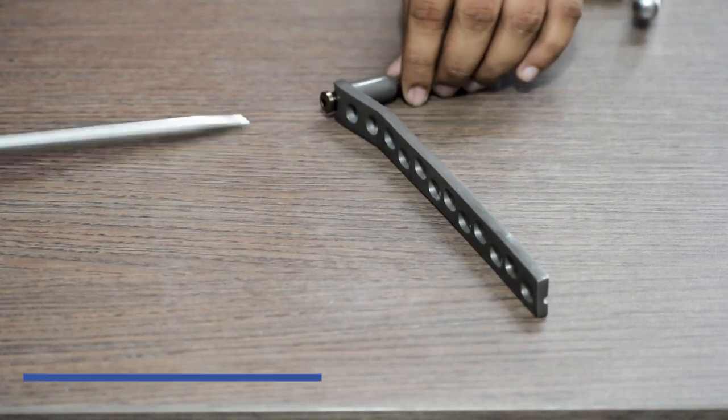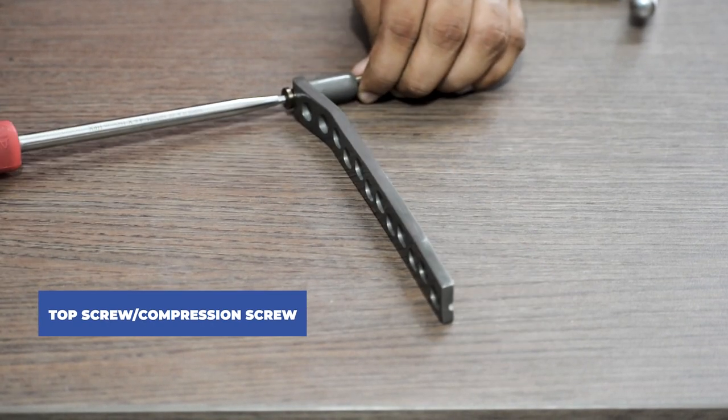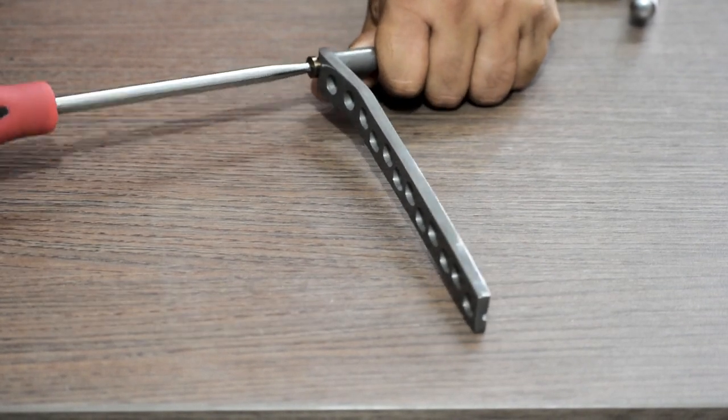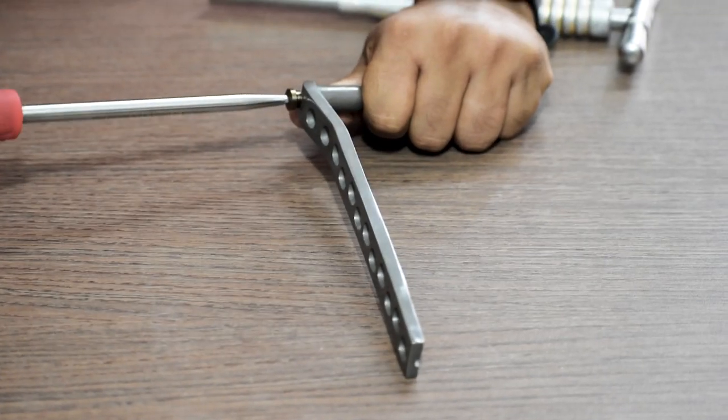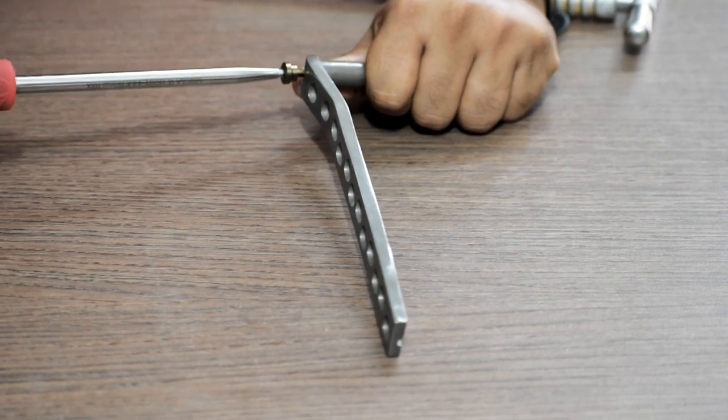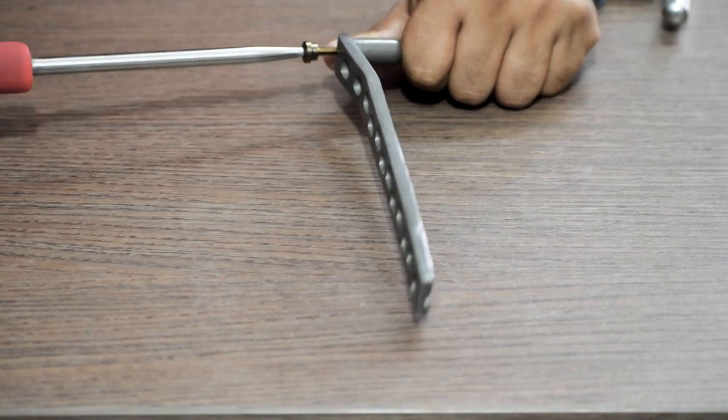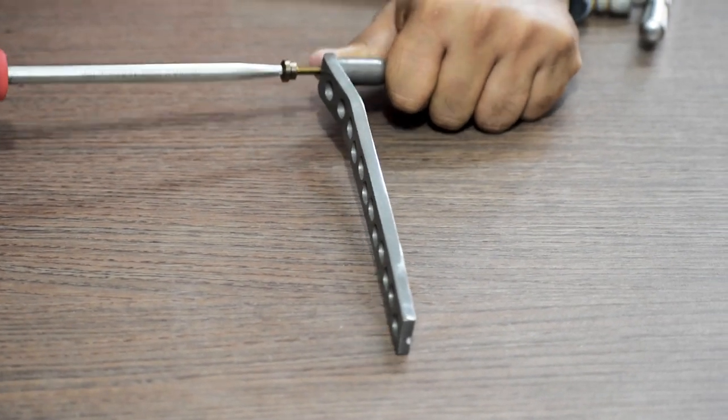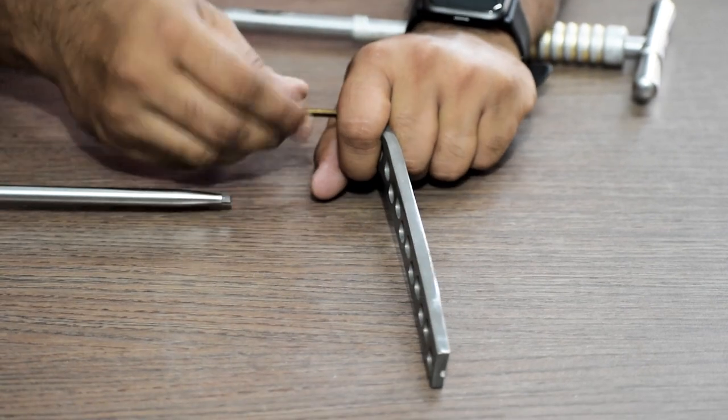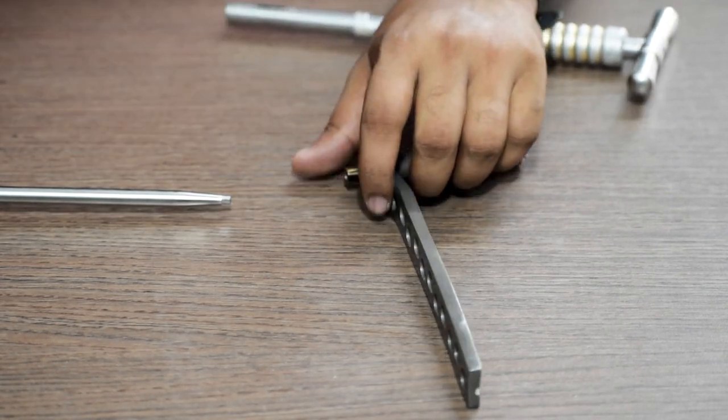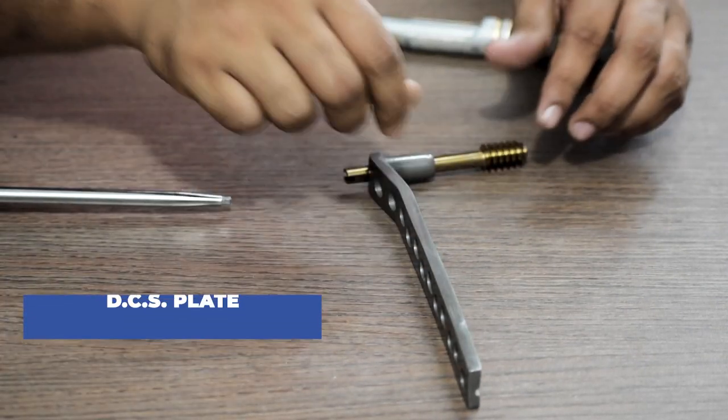Then we remove the top screw or the compression screw. Then we remove the DCS plate.